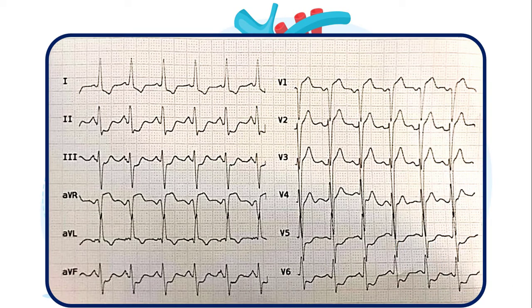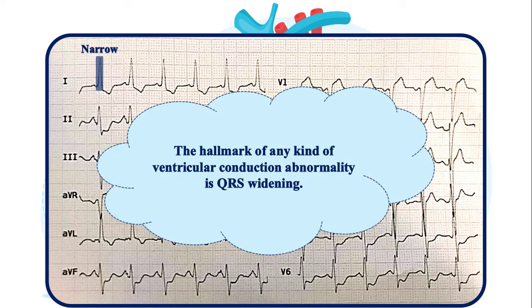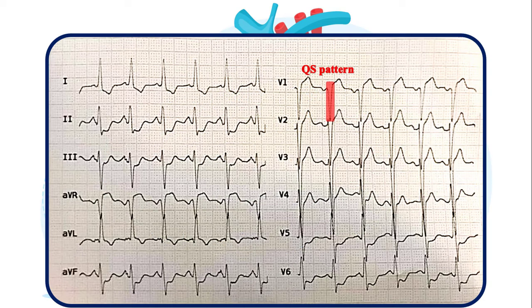Here is one more example. Is it LBBB or not? The QRS interval is about 2 small boxes, so the complexes are narrow and no intraventricular conduction abnormality is present. Note that the hallmark of any kind of ventricular conduction abnormality is QRS widening. Therefore, an isolated QS pattern in V1 does not suffice to make the diagnosis of LBBB. Meanwhile, widespread ST-T wave changes are possibly due to underlying ischemia.